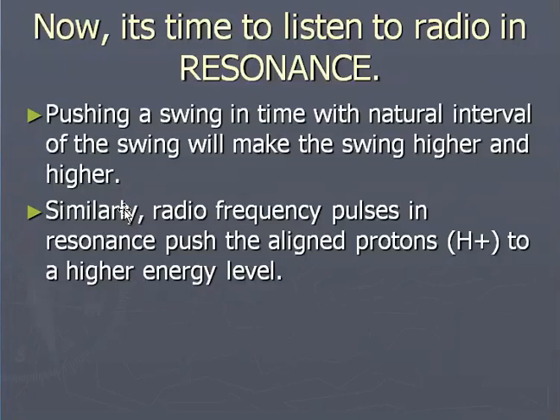So when the protons are spinning with alignment in the presence of a large magnet, pushing a swing in time with the natural interval of the swing will make the swing higher and higher. So we apply the radio frequency. Similarly, radio frequency pulses in the resonance push the aligned protons to a higher energy level.